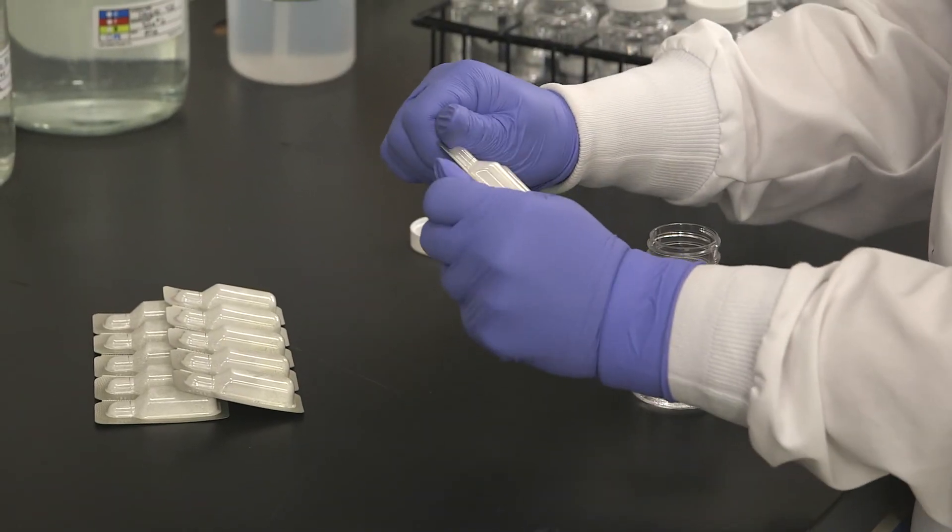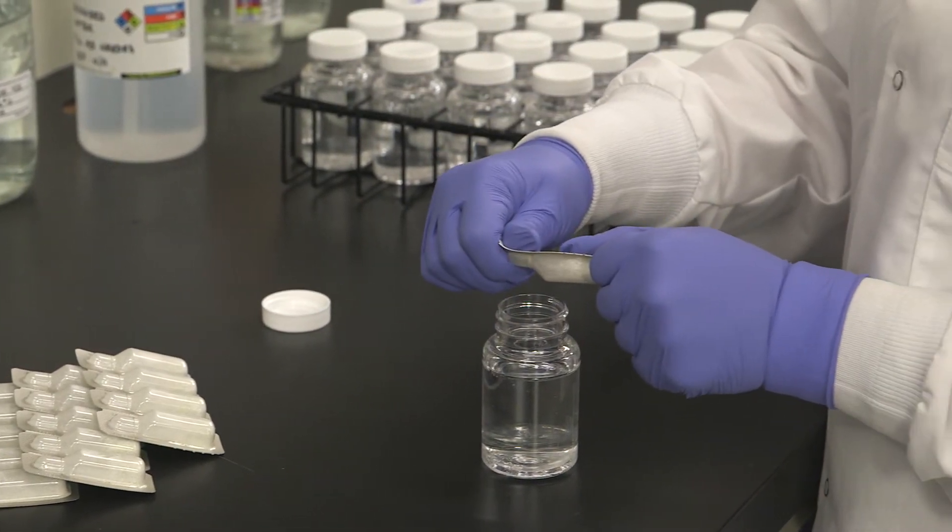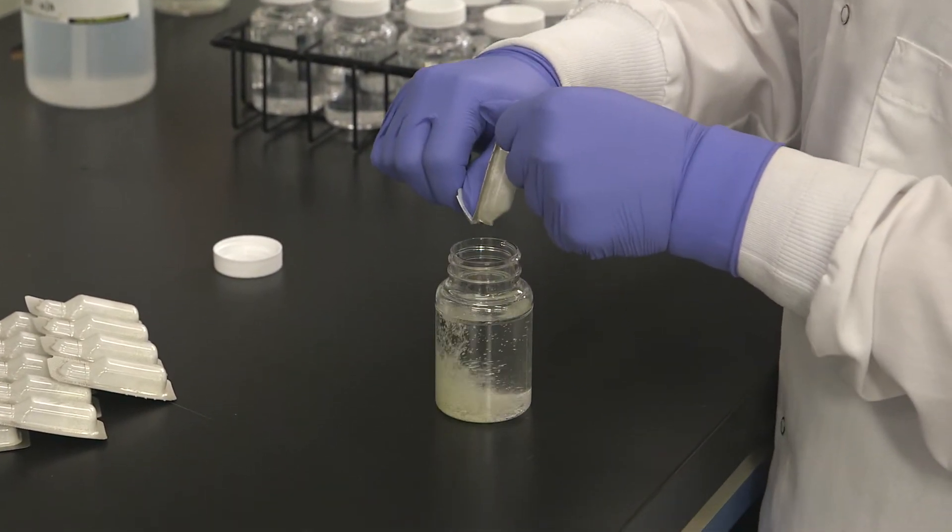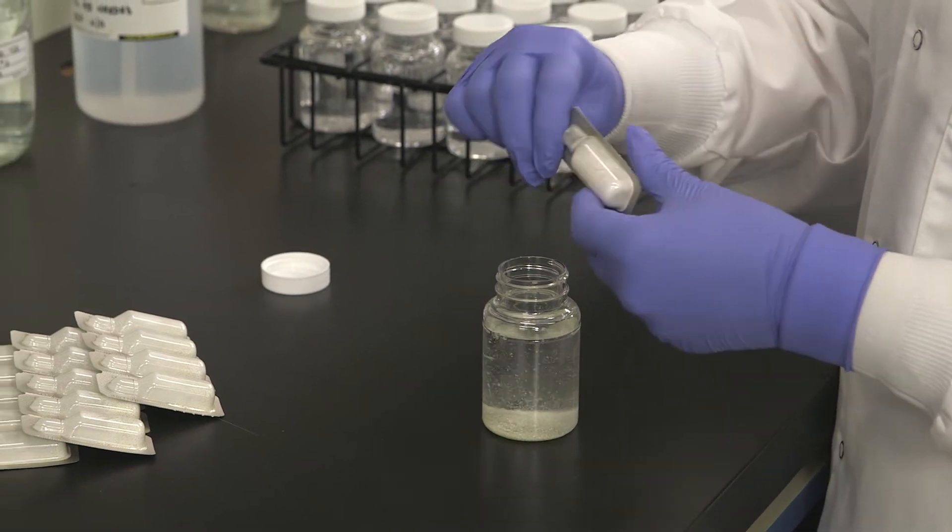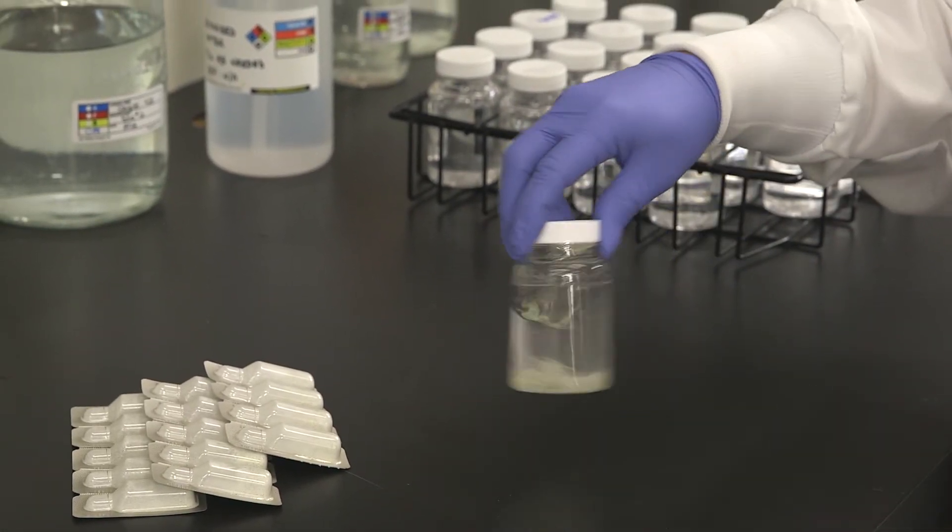Separate one ColiLert pack from its strip, taking care not to accidentally open the other packs. Snap open the reagent pack and pour the powder into a 100ml water sample. Cap the vessel and shake to dissolve the ColiLert powder.